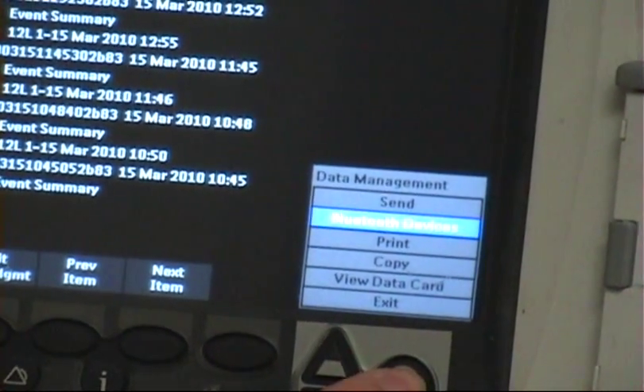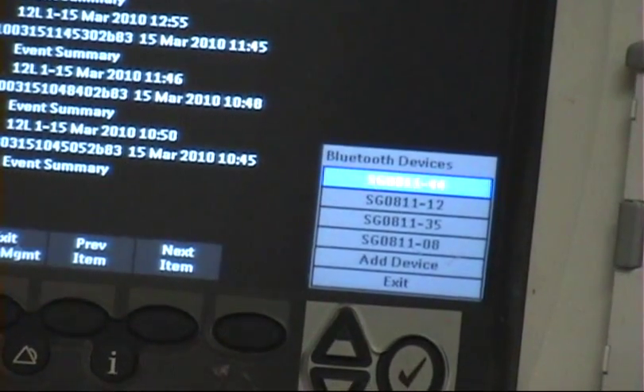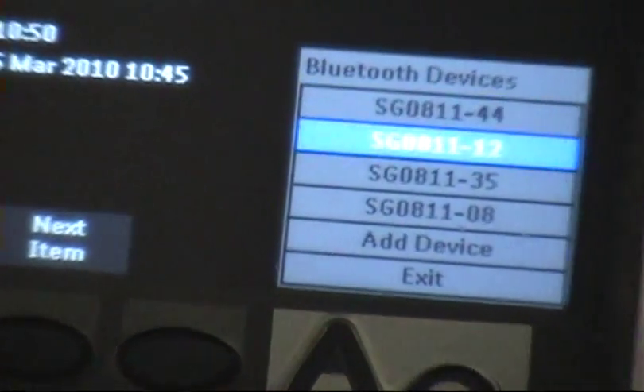It brings you into the data management menu. Select the menu and scroll up to Bluetooth devices, then select that. Now you'll notice you have a list of devices here — this may be all the ones in the area. Unit 44 may already be listed, as this cardiac monitor may have gone out with another device earlier. You want to make sure it's synchronized.